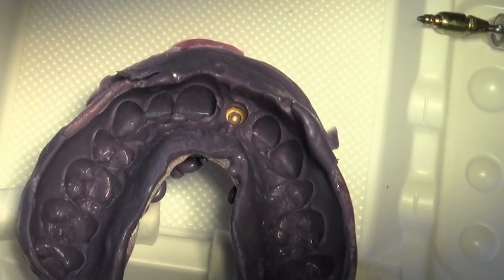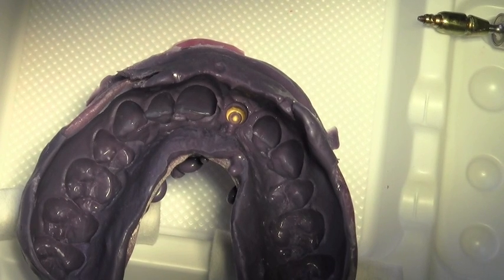Next we have the impression, and you can see embedded in the impression is the yellow coloured transfer cap, matching up to the 3.8mm impression post.